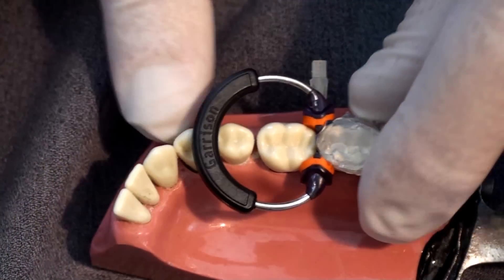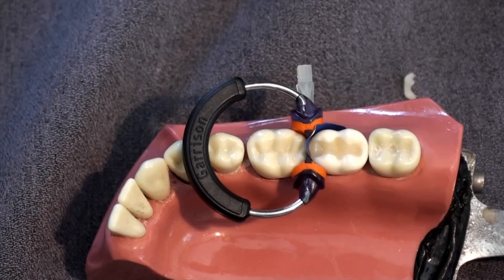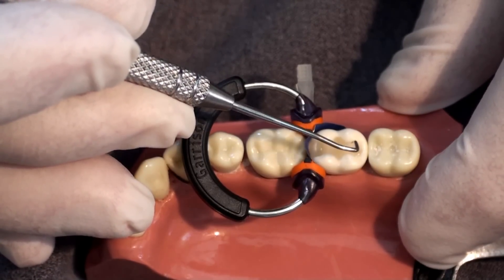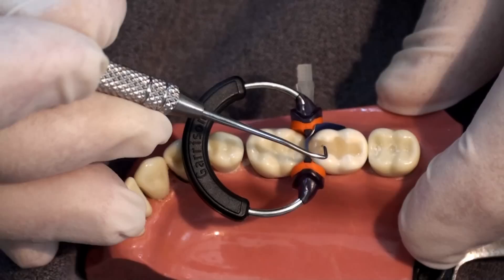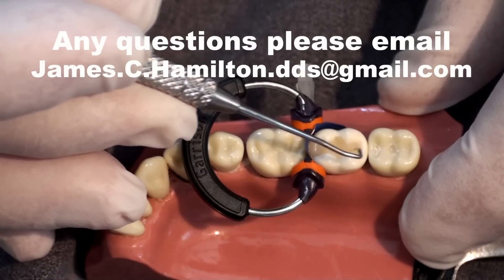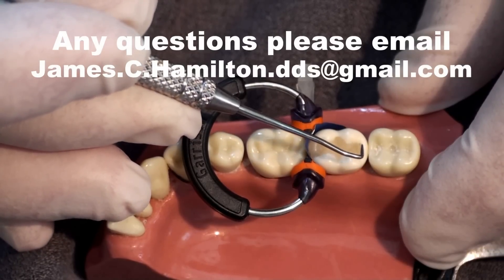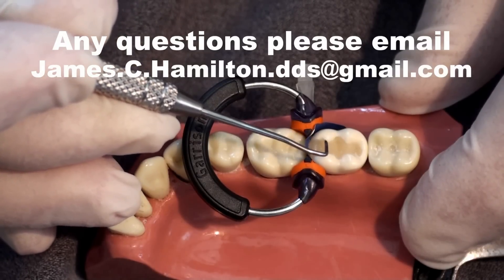The proof of the pudding is right now. Let's probe these margins and the surface. Notice how smooth this surface is — there might be a little catch right here, but in essence most of these margins are perfect. Notice the rounded marginal ridge here. Notice how smooth the surface is. This is going to need minimal shaping or finishing — maybe no shaping at all, and just minimal finishing right here where there's a slight catch.